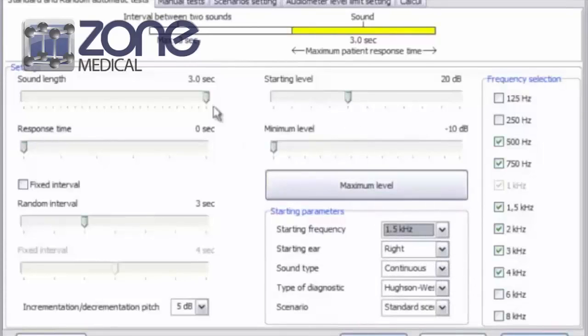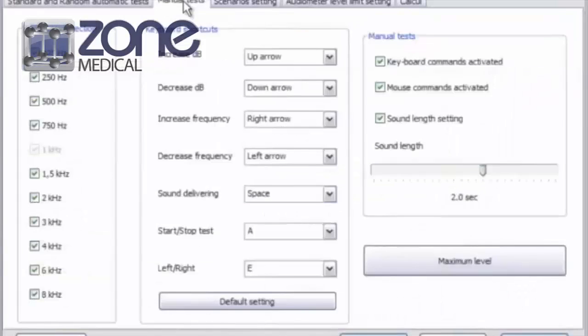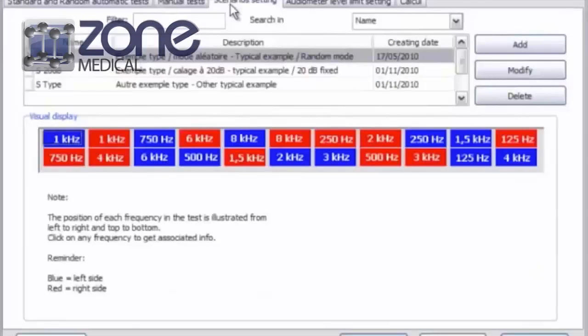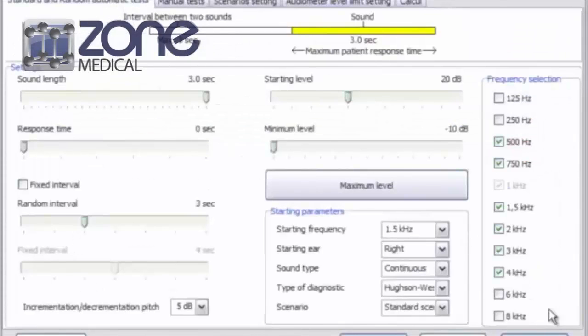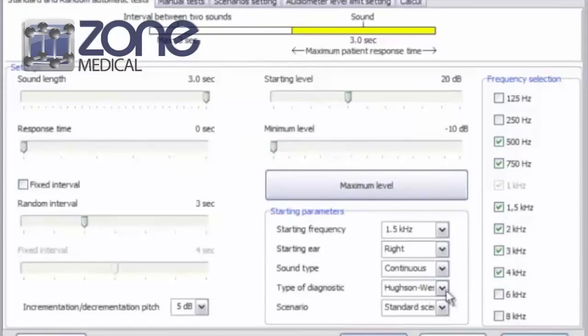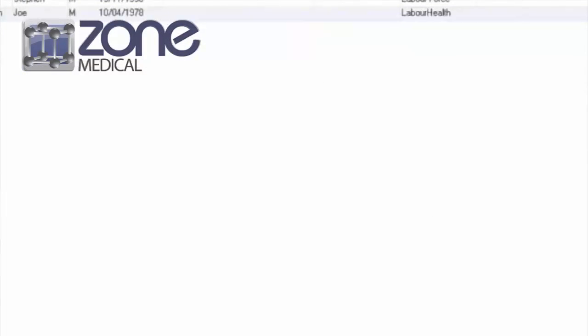For manual tests, if you go to the top of the page, you can adjust settings here. You can also change the scenario settings on this page. These adjustments can be made easily to match your preferences. Once you're finished, just click OK to accept those changes.